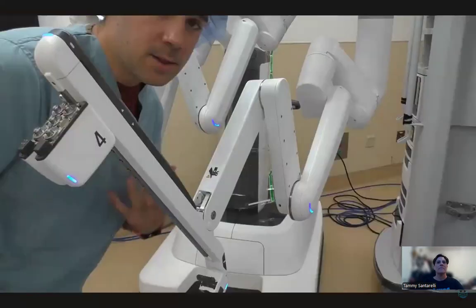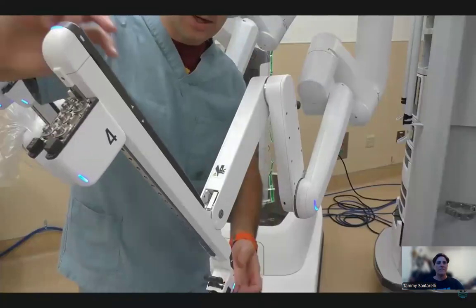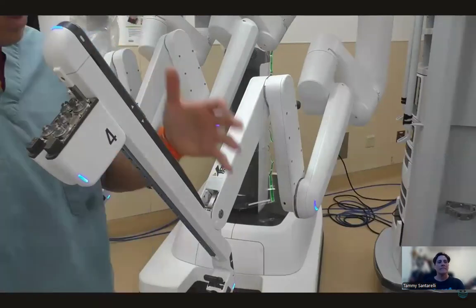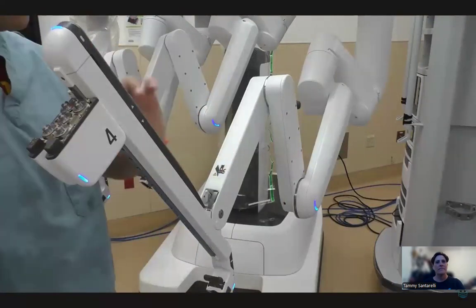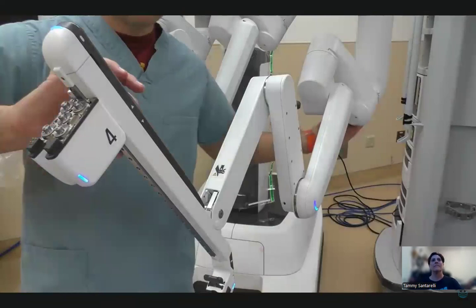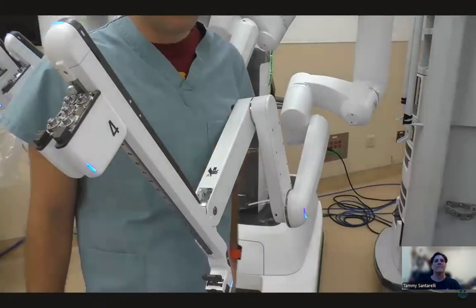I've got one more button to talk about on this arm. It's located on the back side. Remember, we have our two buttons here, but there's also a button directly on the back side of the arm. And this button is specifically for patient clearance. If after you dock your robot and you have all your instruments in place and the surgeon's moving around and working on the case, and you notice that these arms are getting close to the patient, you can use this patient clearance button to move an arm out of the way to make sure that you have enough clearance so it's not going to be harming the patient.